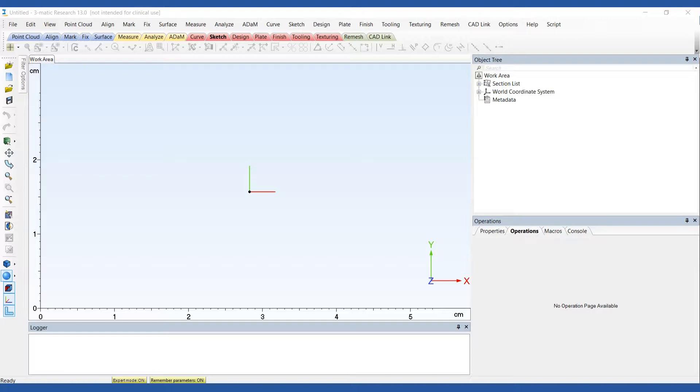3D printing allows you to create patient-specific replicas of actual anatomy. You can design and print a benchtop model based on one patient's data or on a population average.